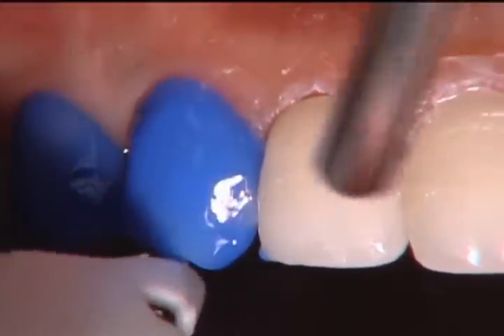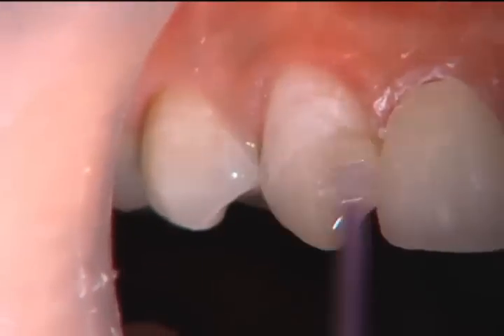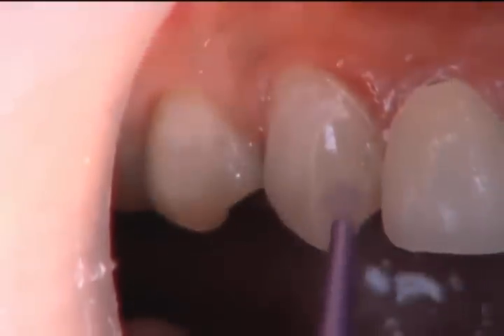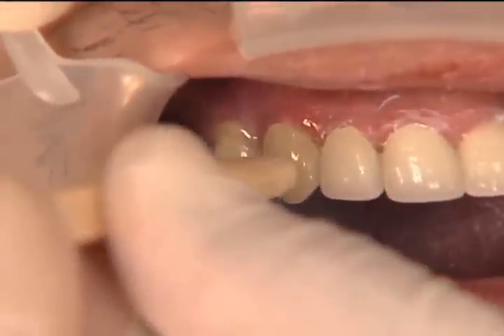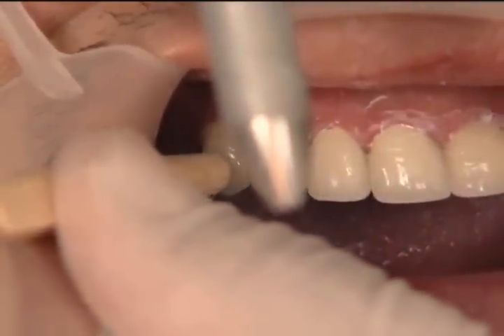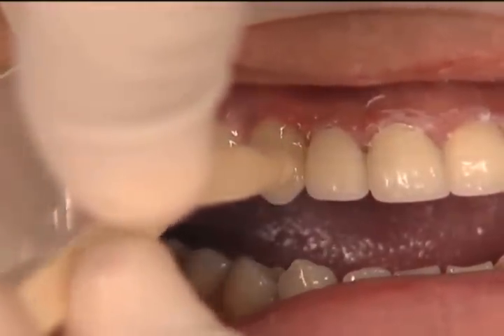Over on the other side, we etch teeth 5 and 6 and place bonding agent just as we did on the other side. The patient had bicuspids removed earlier in life, so we only have the cuspid and one bicuspid. If there were another bicuspid, we'd probably place a veneer on that too — it fills out the buccal corridor and makes the smile look uniform. These no-prep veneers are a great way to finish off a smile and turn it into a whole smile case. The thin-press material from Glidewell we use for these is very strong — stronger than other pressed ceramics — and I've never had one break when seating it with the orange wood stick.